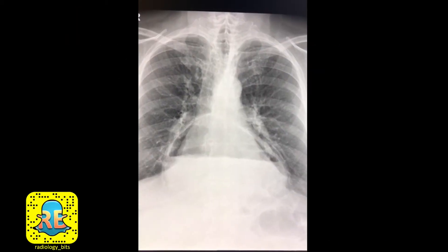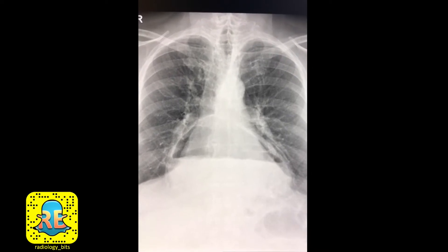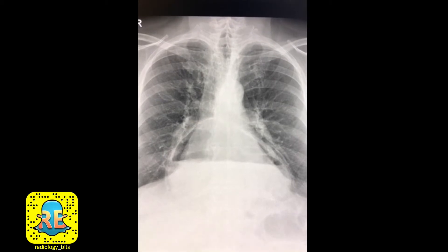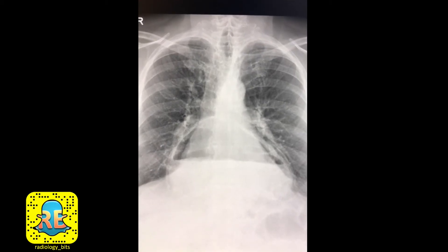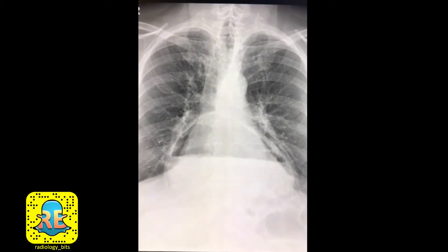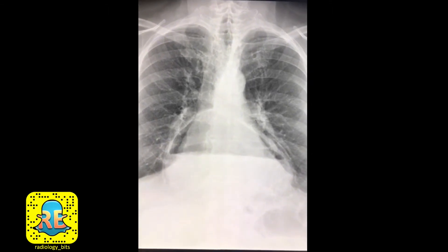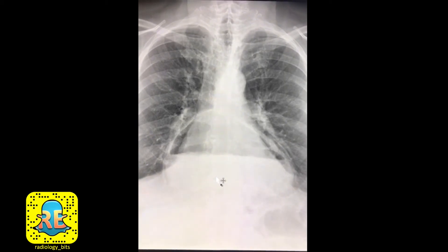Welcome again everyone. This is a quick case for students, interns, and junior radiology residents — seniors, this would be easy for you. Students and juniors, you're looking at this patient who has chest pain and you see this funny appearance. We'll explain it one by one to make it a bit easier.